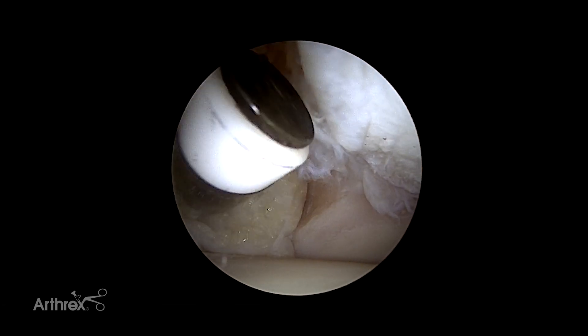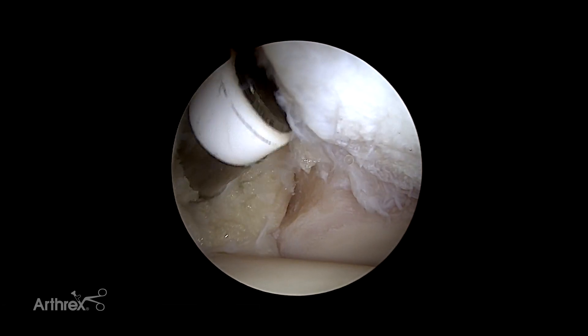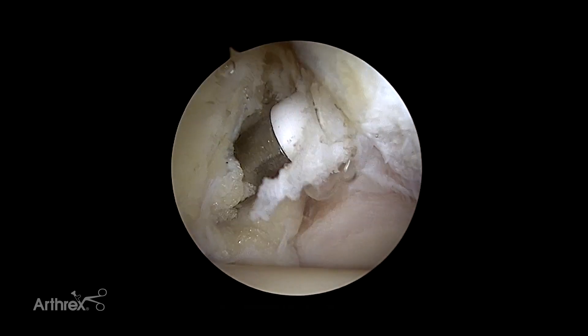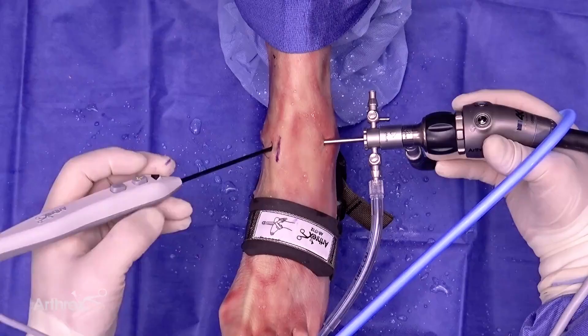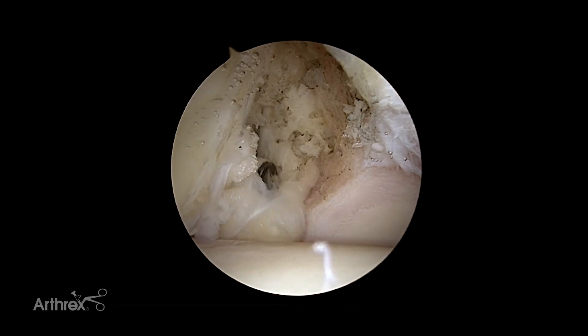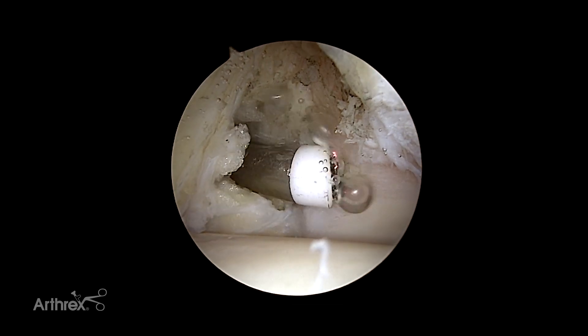My probe is now between the anterior capsule of the ankle and the anterior edge of the tibia. Very commonly we want to get rid of all the synovitis if we're doing an anterior cheilectomy, and the beauty of this probe is you can get right up in that area and on cut, literally clean this whole area up. I'll give it a second breath every five or six seconds — I like to let the aspiration get rid of any warm fluid so I can keep the whole joint space nice and cool.